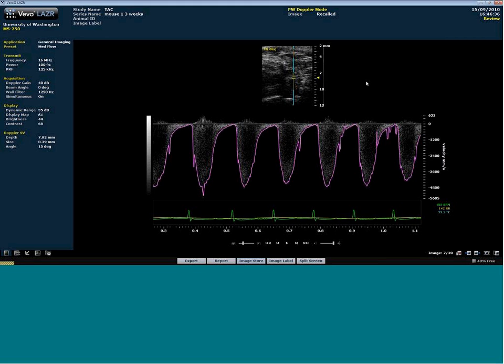That's good. And I just pointed out to everyone, we did add our email addresses for both Stephen and myself, so if you do have more specific questions, and for this specific listener who is asking about these Doppler velocities, we can certainly send along that sheet that you were talking about that allows you to calculate ahead of time. But I think really the point that you can see, sometimes there really is a trade-off in terms of the resolution and the maximum velocity.